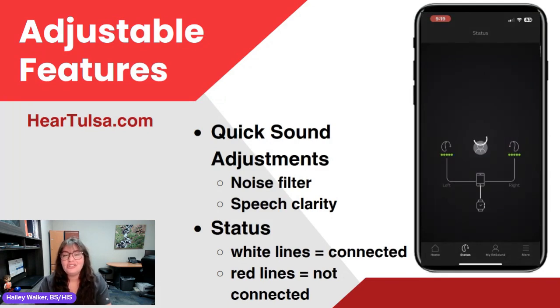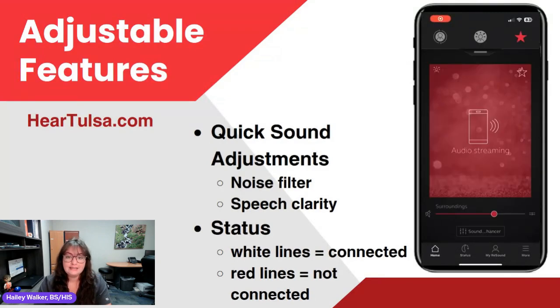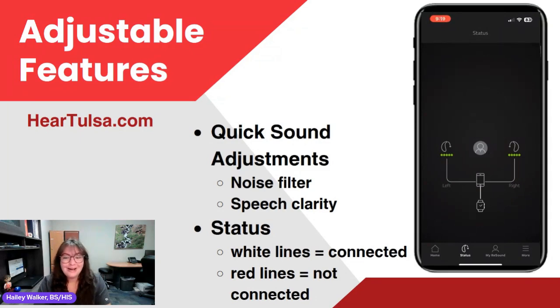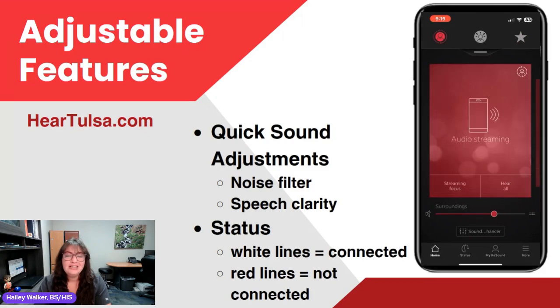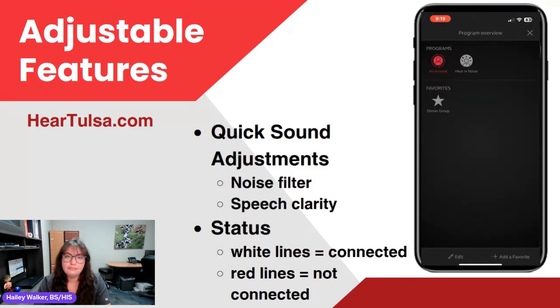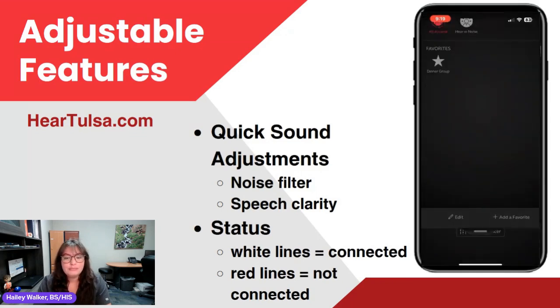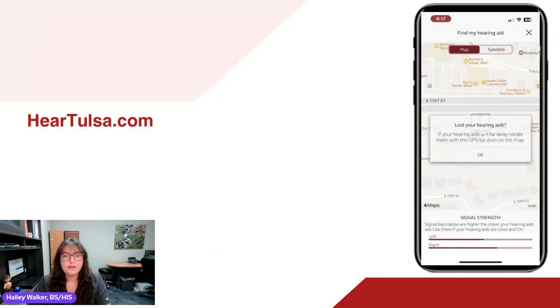That's all on the home page. Our next tab over is status. Status is going to show us what's connected and how much battery is left. White lines from your phone to your hearing aids show you're connected. If you see red lines or any red on that page, something's not connected or something's going wrong. We can see the names of those programs as well. If we pull down on that bar underneath the programs, we can see that overview, but we can't adjust programs from that menu.